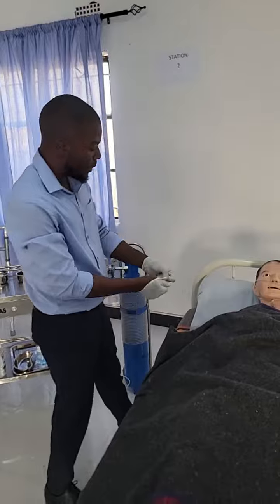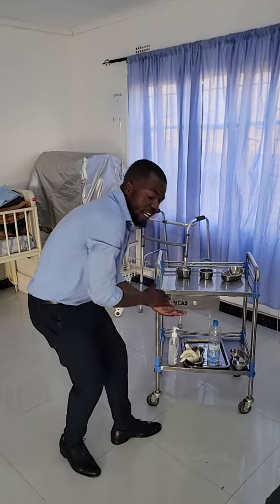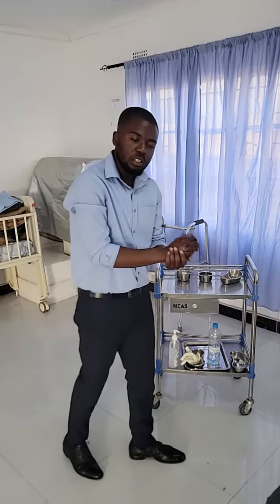Then the next thing you do is to remove gloves, and you end the procedure by washing your hands.